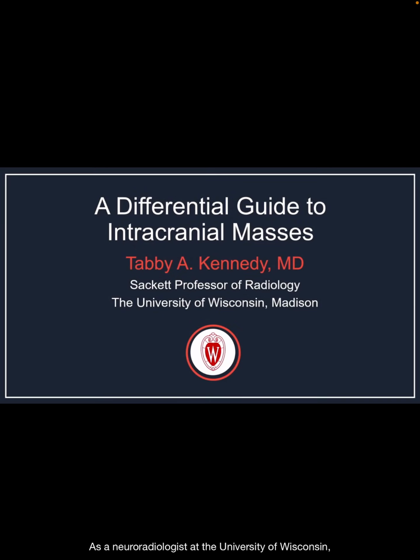As a neuroradiologist at the University of Wisconsin, I'm confronted with unknown intracranial masses every day in clinical practice. And I have to create a reasonable differential diagnosis, which is informed by the patient's clinical history, location of the lesion, and imaging features. That's the goal of my talk today.